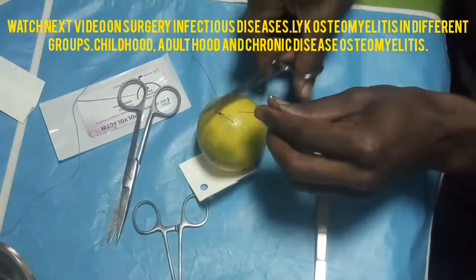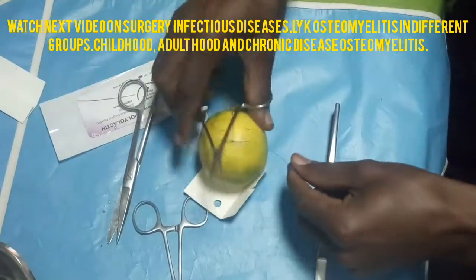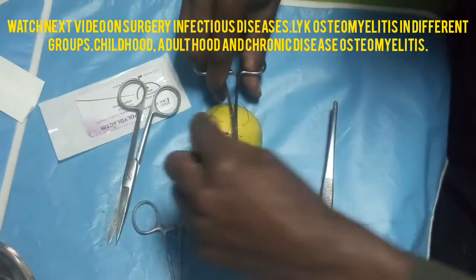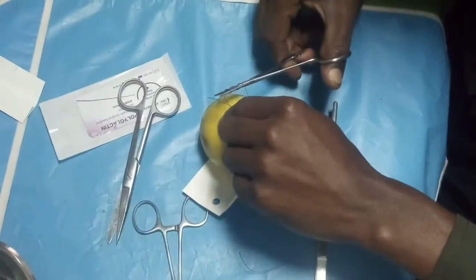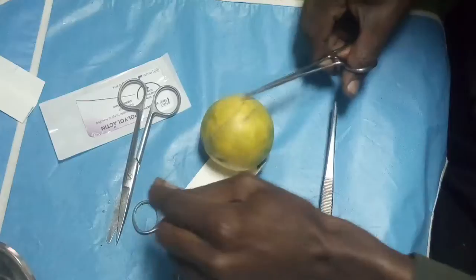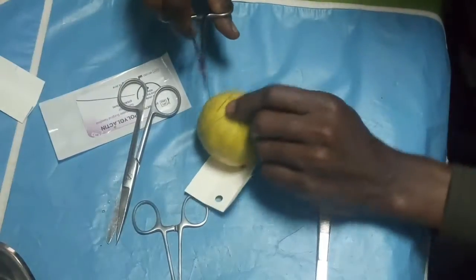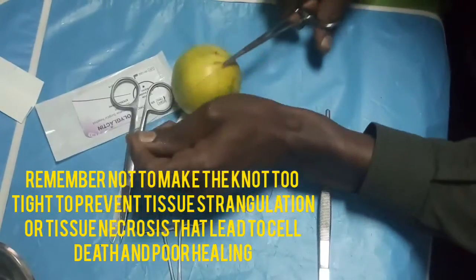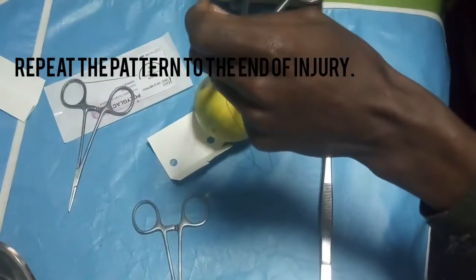Remember, we are going to study all types of injuries that appear in the surgical area. You put the needle holder between the entry point and exit point. Then you count the 3 counts, 1, 2, 3. You clamp the entry point. You just pull like this to make a knot. You count 2. You clamp the entry point, and you just pull to make a knot. Then use the scissors to cut.